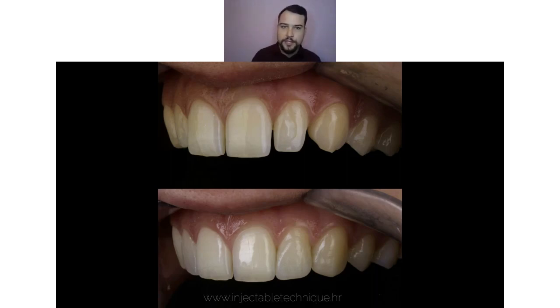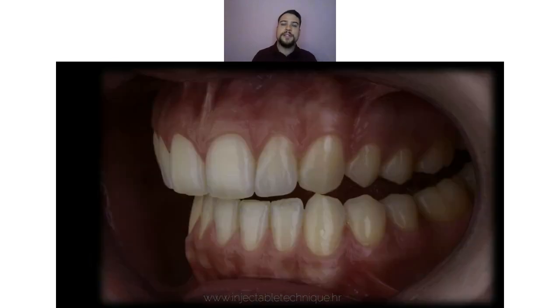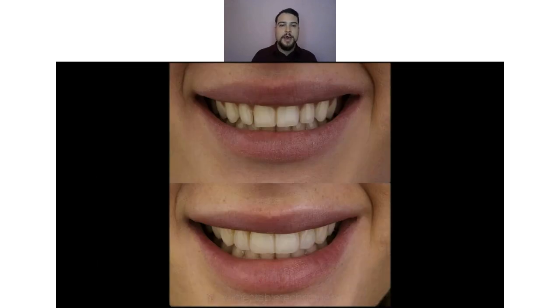This is done with a single shade, the lateral incisor and canine, but also how to recontour the function, because as I mentioned, the function is the key for the longevity of your veneers, in a very predictable and precise way. As mentioned, you plan everything in the articulator, you can plan everything perfectly, and then just copy it in the patient's mouth. How to recontour the smiles with super thin veneers.